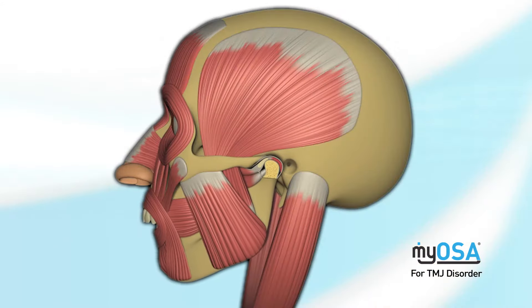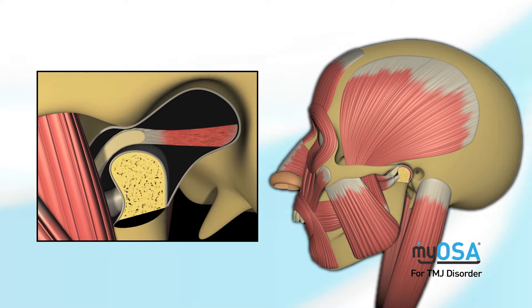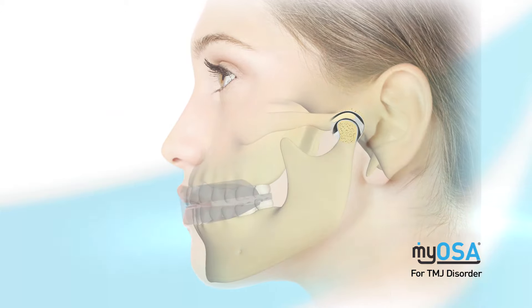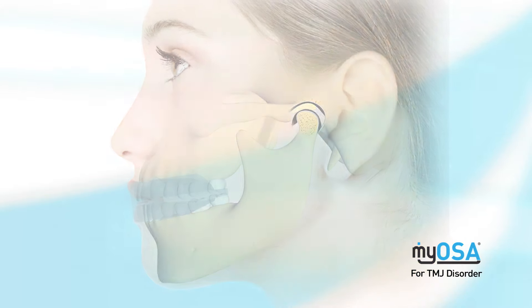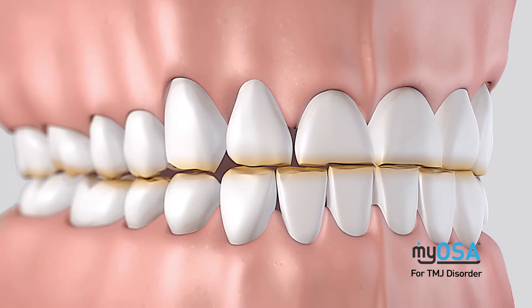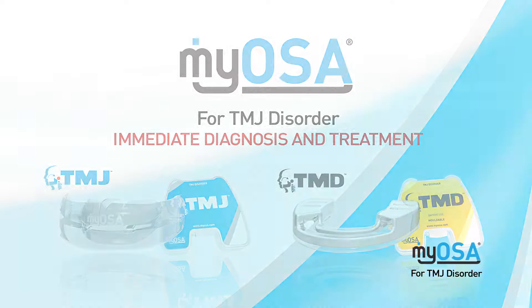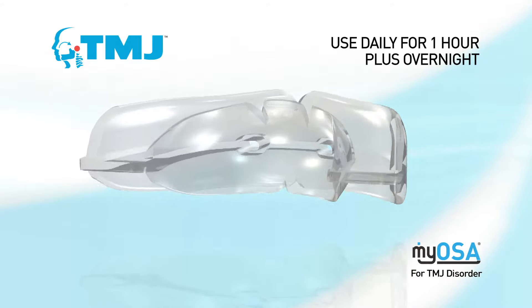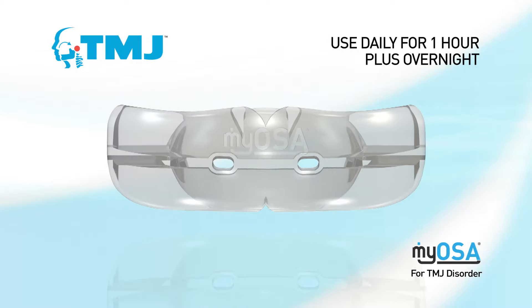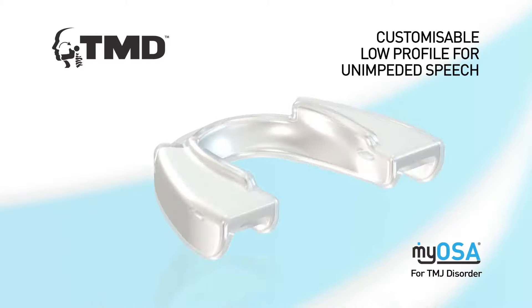Because TMJ disorder involves the teeth, facial muscles, and jaw joints interacting to produce a wide range of symptoms, the Myosa for TMJ disorder range works by decompressing the TMJ and moving the mandible into class 1, while treating mouth breathing, incorrect myofunctional habits, and bruxing. The Myosa for TMJ range includes two appliances: the TMJ appliance, specifically designed to act as a universal initial diagnostic and treatment tool for TMJ disorder, and the TMD appliance, which features a comfortable low profile allowing for daytime use and unimpeded speech.